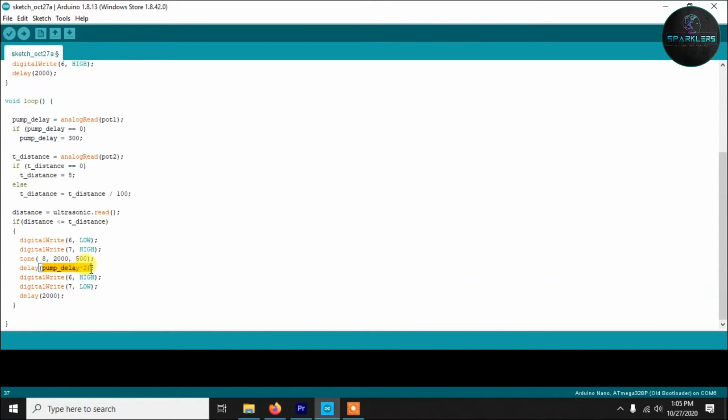Now this amount of time is equal to the pump delay times 2. Remember that pump delay is from 0 to 1023, which, if you talk about milliseconds, is from 0 to 1023 milliseconds. That means 0 to 1 second. Now I am just multiplying it by 2 because in my case I need a little bit more time, just to increase the delay. In your case, it may be just the pump delay, or maybe times 3, times 4, whatever you want. You just check at which value you are getting good results, and use that.